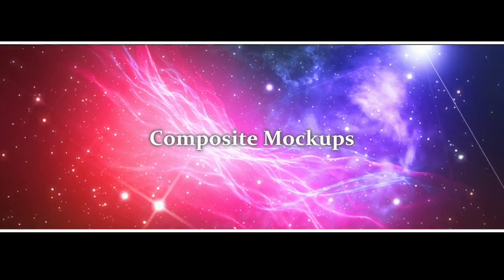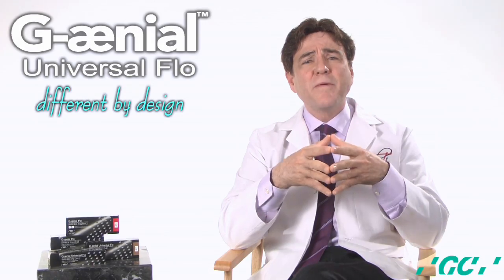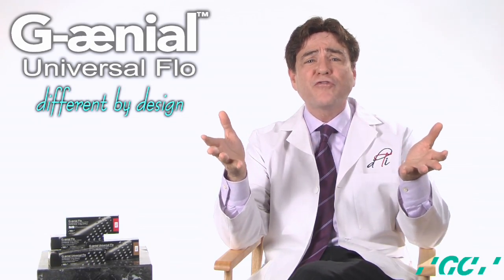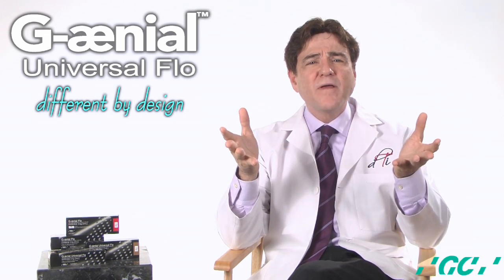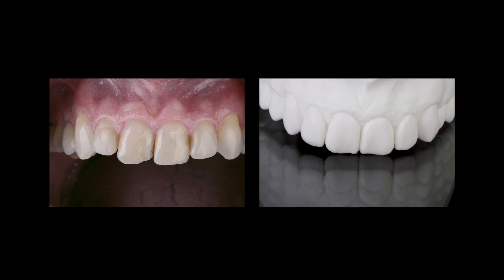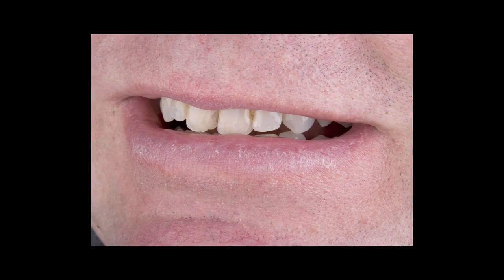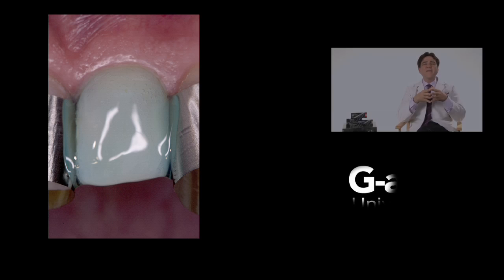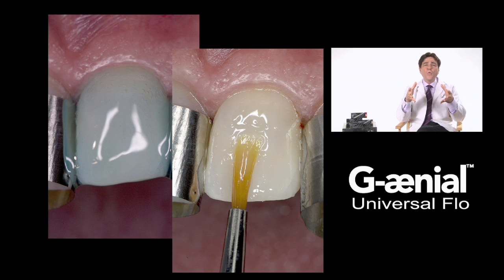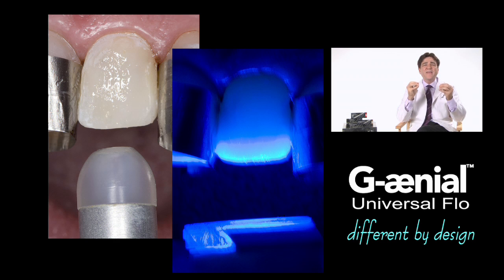For composite mock-ups, the composite mock-up is an excellent tool for increasing the patient's understanding and education of the clinical procedure through a visual prototype. This composite prototype allows the patient and the restorative team to establish parameters for lip profile, incisal edge position and length, and orientation to the gingiva, and to simulate the final result. This process can be performed intraorally, without anesthesia, and can provide valuable information for proper lip position and phonetic considerations.